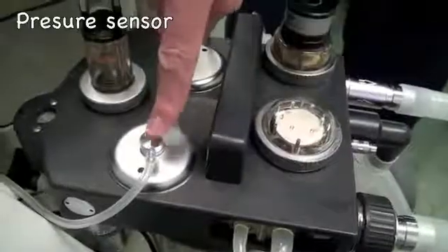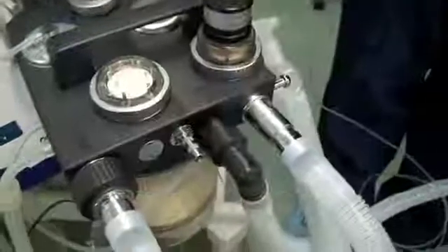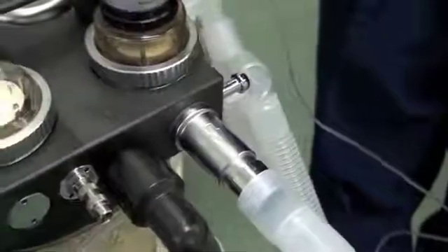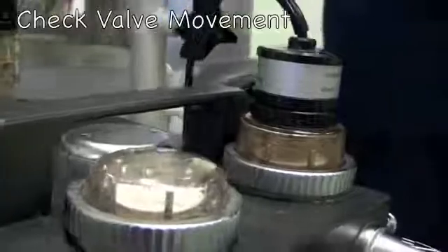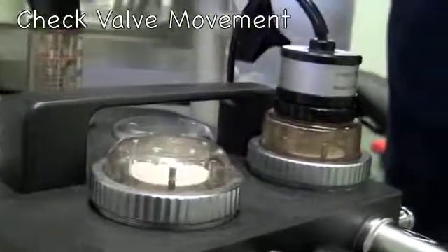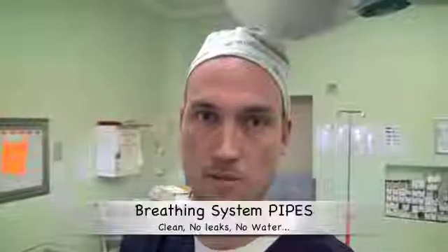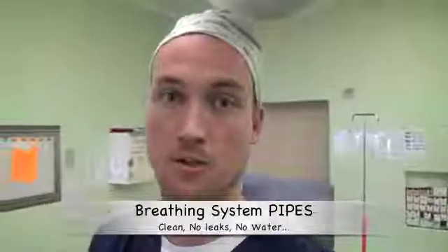Other components of this breathing apparatus include a pressure sensor and a flow sensor. One needs to check that these are connected appropriately to the breathing circuit and to the back of the machine. There are two limbs to a breathing circuit: an inspiratory limb and an expiratory limb, each with its own valve. One needs to check the function of those valves by squeezing the bag and watching for movement. It is also important to check the piping for cleanliness, absence of leaks, and absence of water.